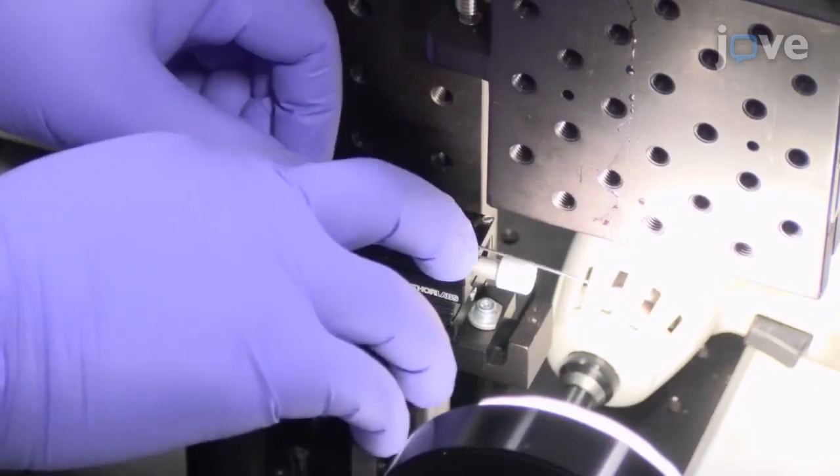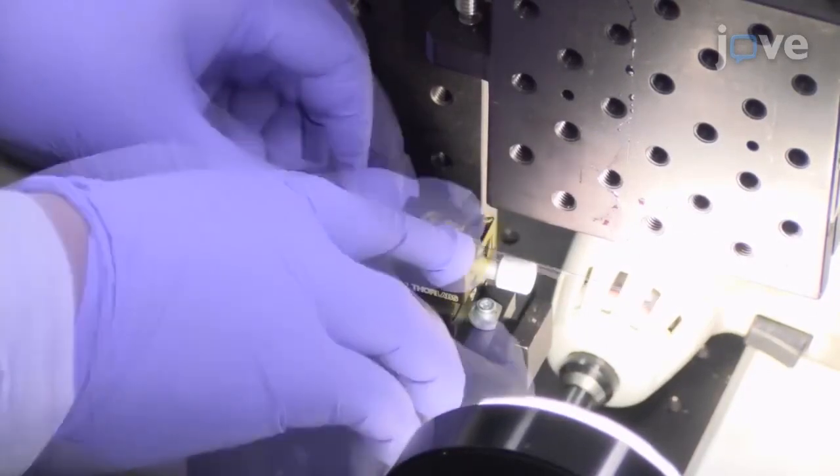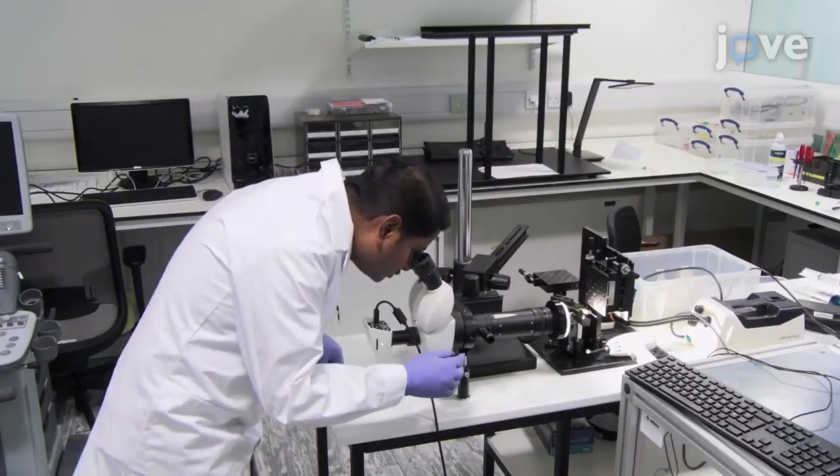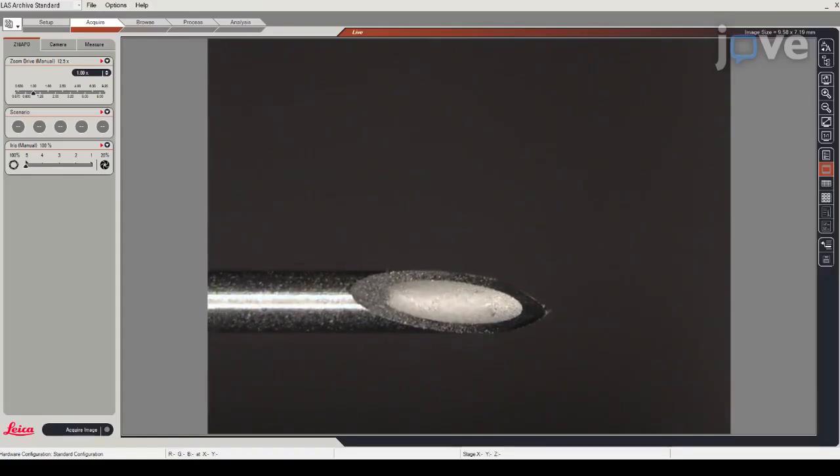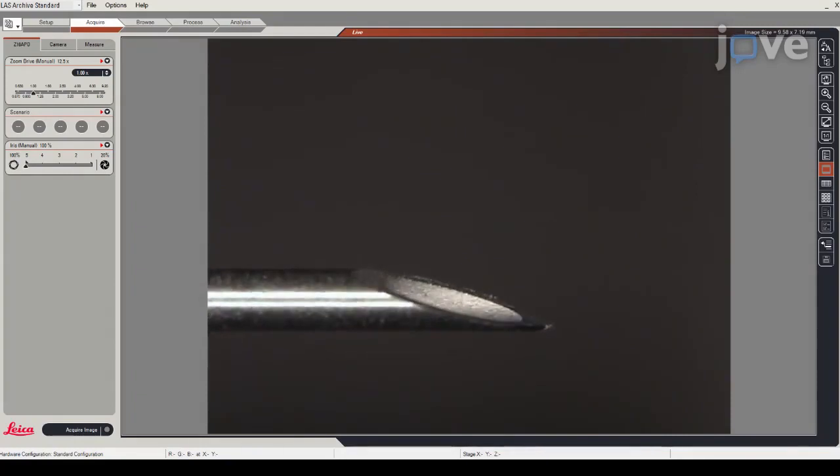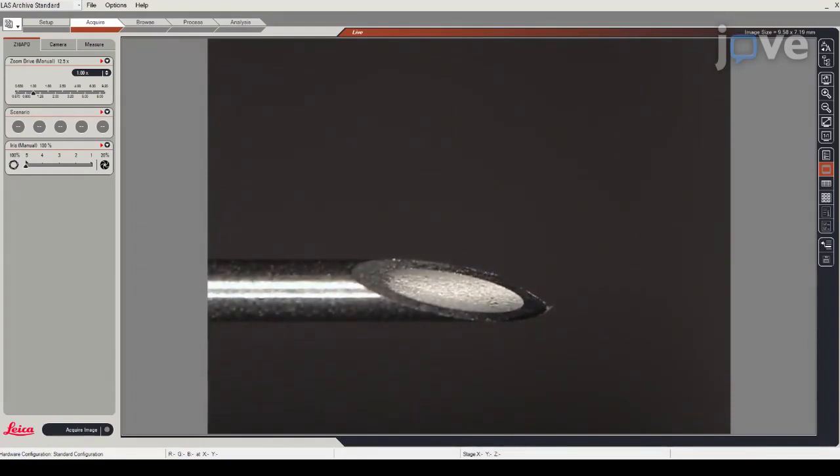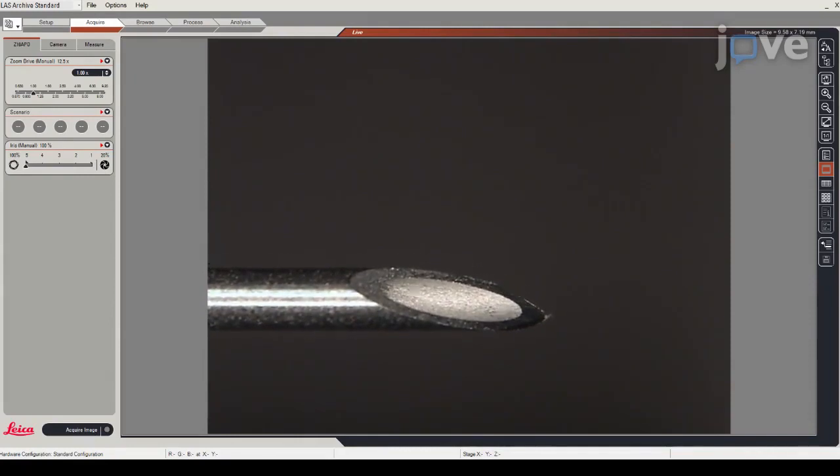Next, affix a medical needle horizontally to a manual horizontal translation stage and use a stereo microscope to visualize the needle tip with the optical axis of the microscope aligned horizontally and perpendicular to the needle, rotating the needle about its axis as necessary until the bevel can be observed.